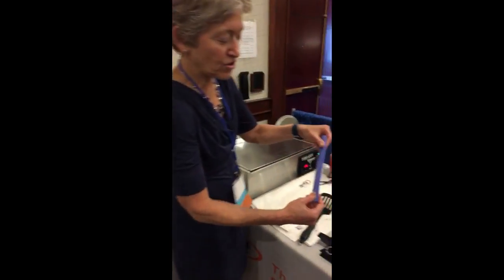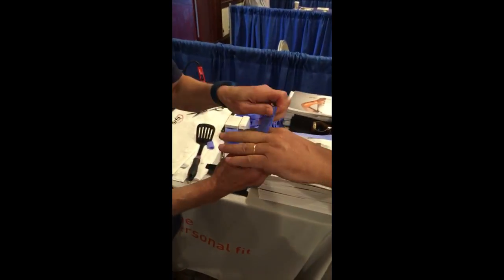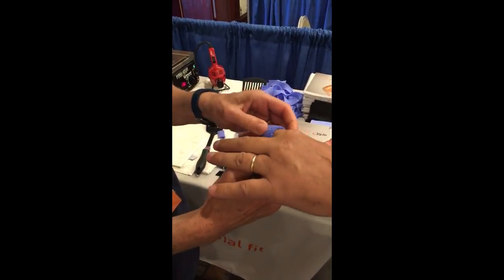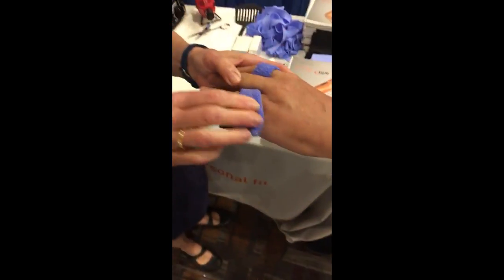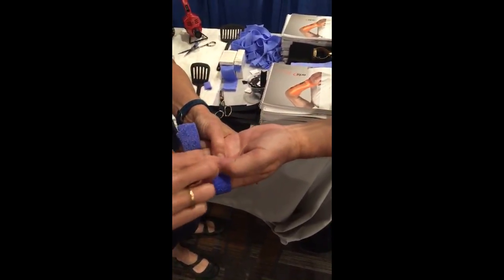I'm folding the material in half to the width of a proximal phalanx. I'm going to wrap it around the index finger, okay? Wrap it around the ring finger. We're just going to turn your hand over so they can see. Oops. Want it to stick.